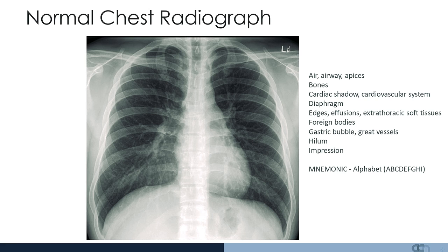So this is a normal chest radiograph. You can see that the lung fields are clear. The trachea is nice and visible with a good bifurcation without any deviation. The spinous processes are found equidistant from the medial heads of the clavicles, and there's good inspiratory effort and good penetration. There's no obvious fractures, assessing the ribs both on the left and the right as well as the spine. The cardiothoracic ratio is less than 50%, suggesting no evidence of cardiomegaly.